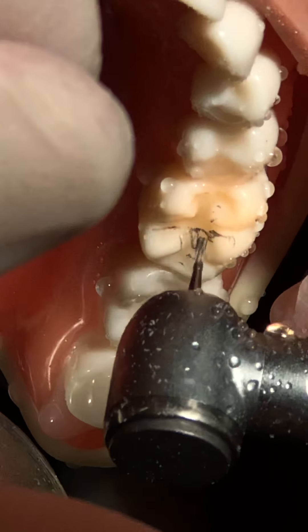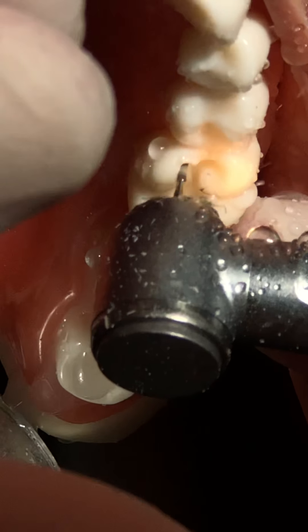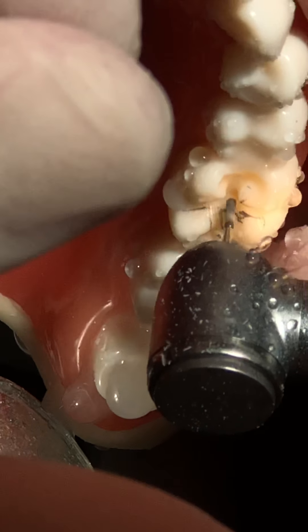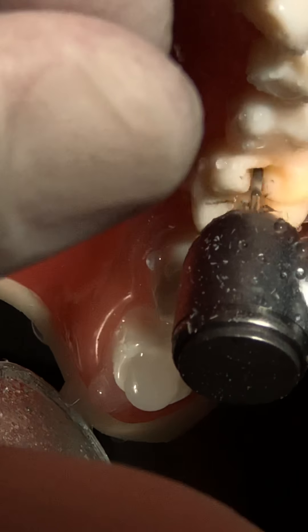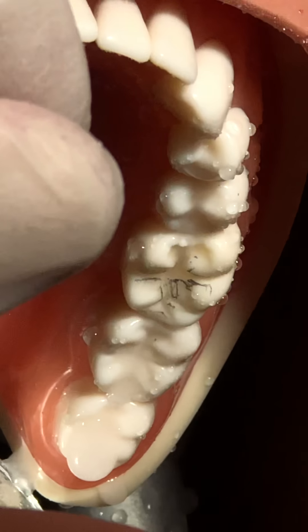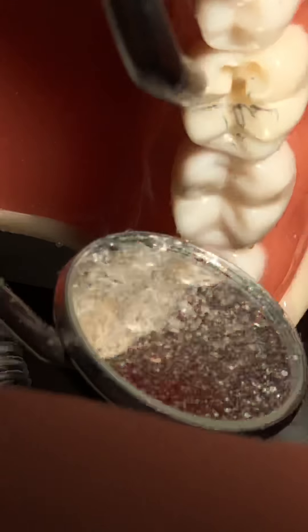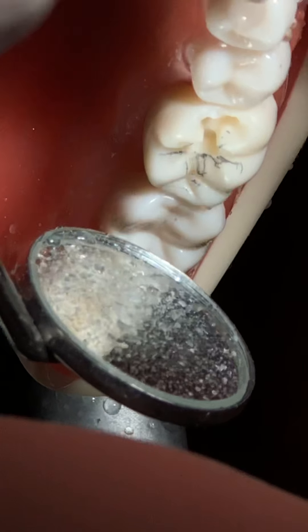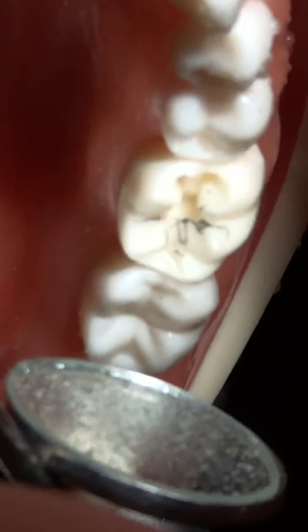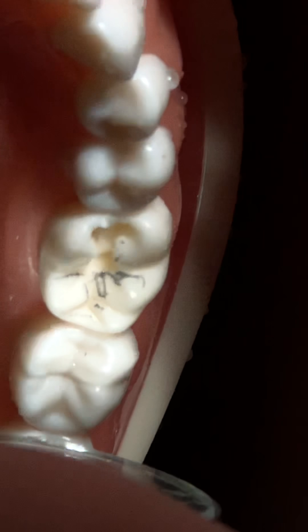Following the fissures in the margin ridge gives us an indicator of where the contact point is and where we should go. I'll show you again where I am actually going. You can see the design of the cavity - the outline form - and my intention of going into the margin ridges.